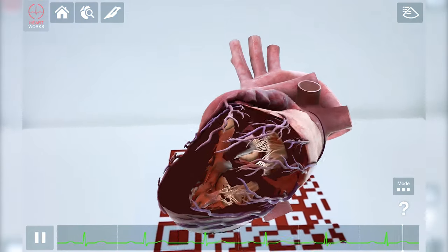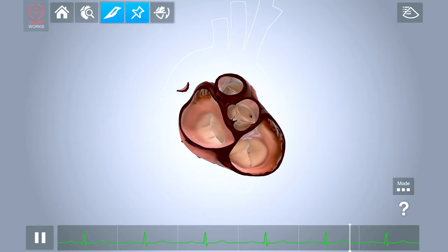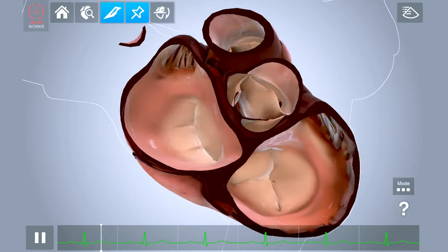As well as using AR, the model can be explored using a 3D viewing mode. The 3D heart can be manipulated simply by dragging your finger across the screen.